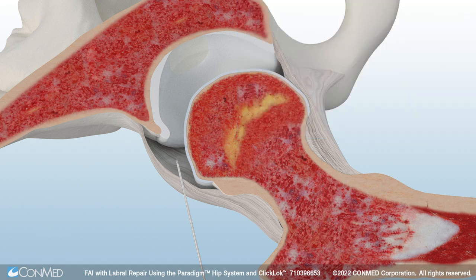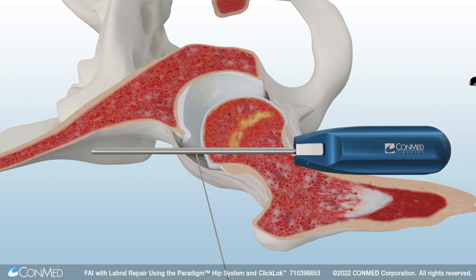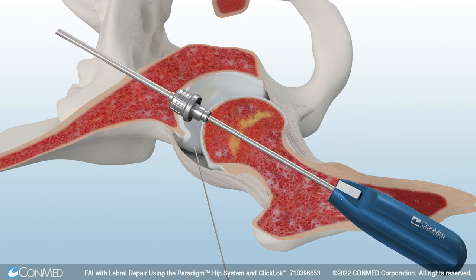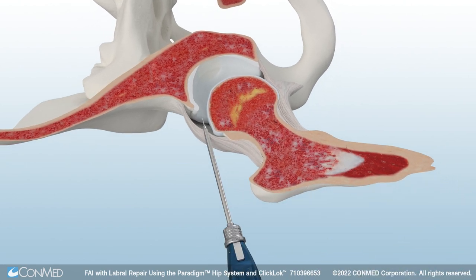The tactile needle is cannulated to accommodate a guide wire. After the guide wire is inserted, remove the tactile needle. Then insert a dilator over the guide wire. ConMed's 4.6 mm double-latch cannulated obturator and hip-length metal cannula feature Quick Connect technology and are fully cannulated. Insert the obturator and cannula over the dilator, then remove the obturator and dilator.